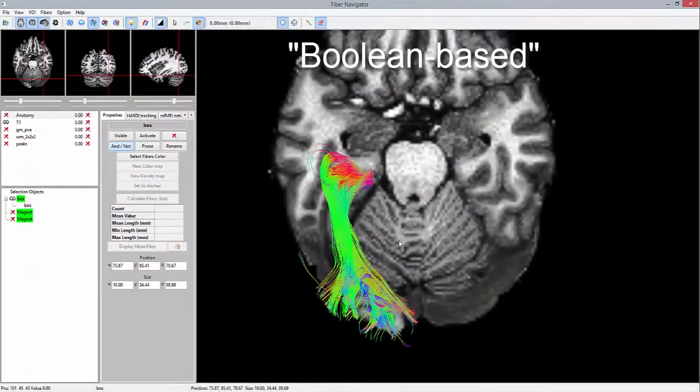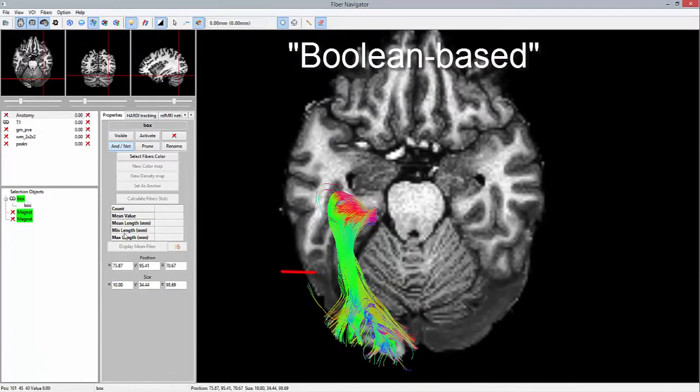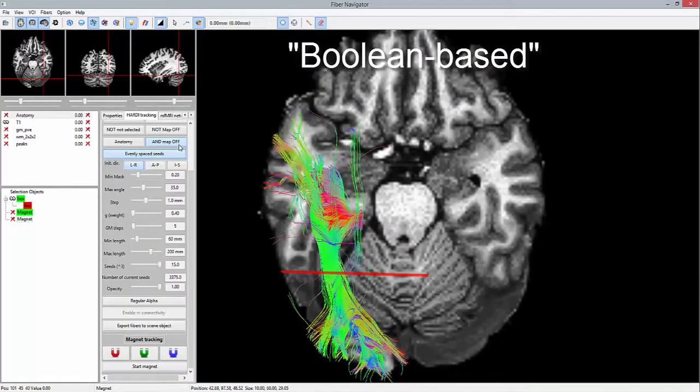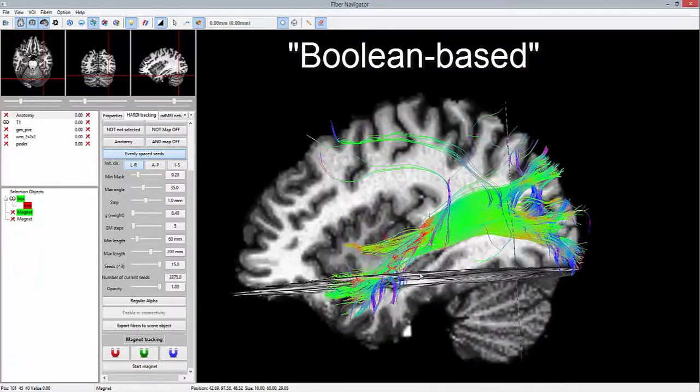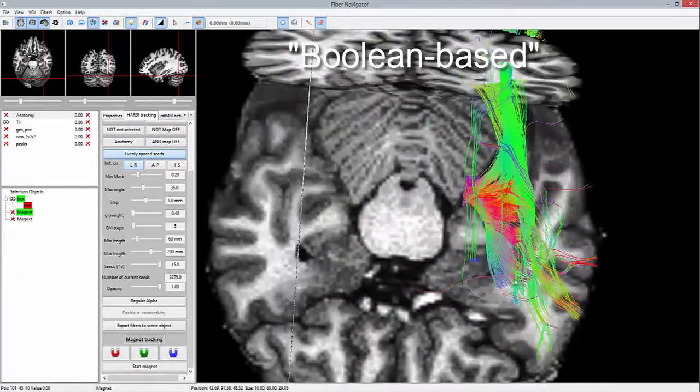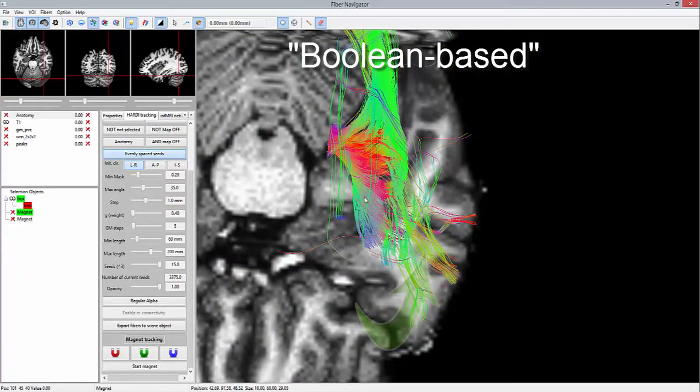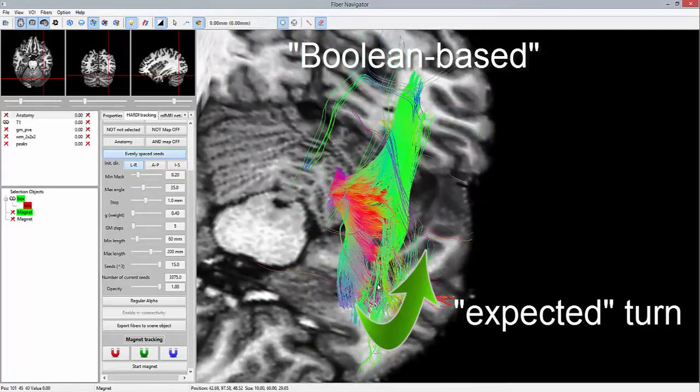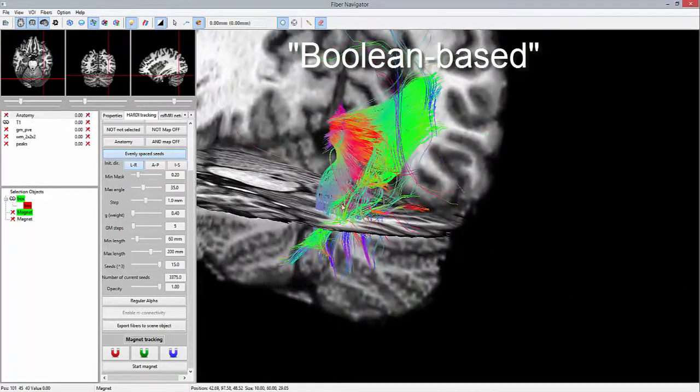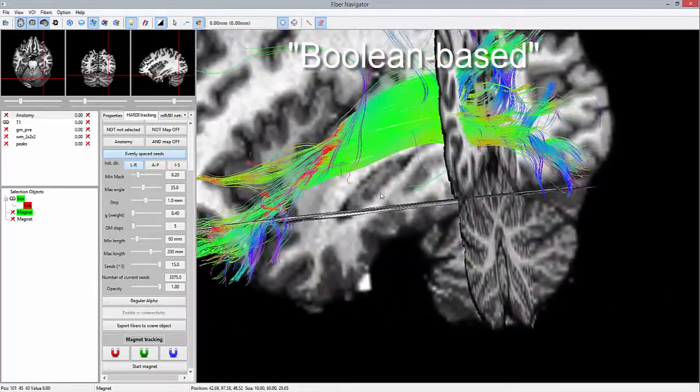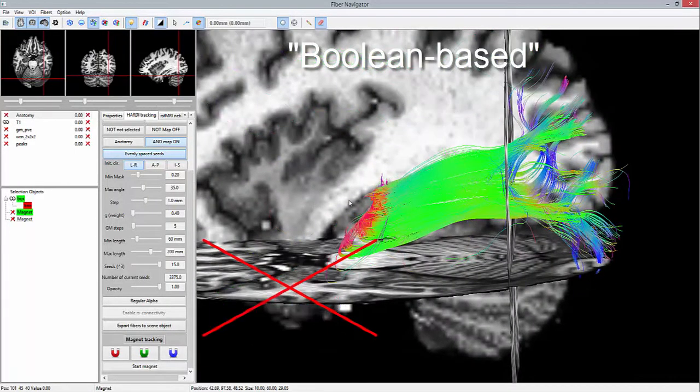The first thing we want to point out is, if we remove the inclusion ROI, we notice a fair amount of invalid connections, mostly propagating towards the temporal pole. This effect is observed because of the underlying rule for connectivity, which states that directions should be maximally aligned throughout the brain.